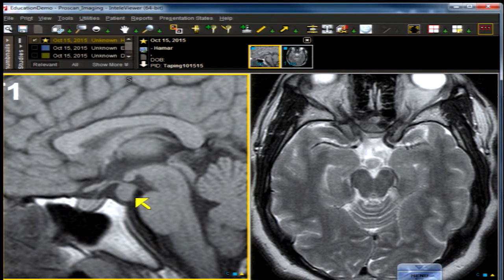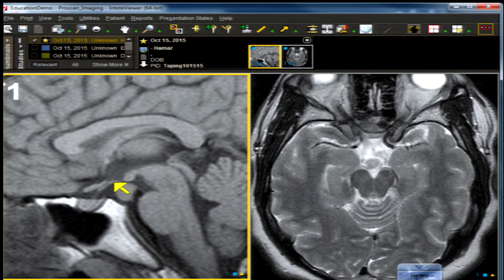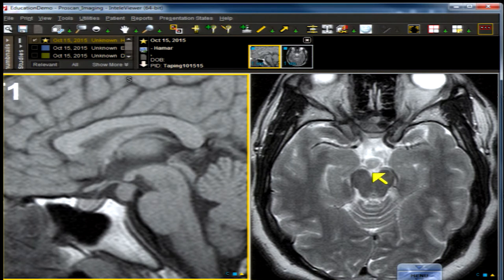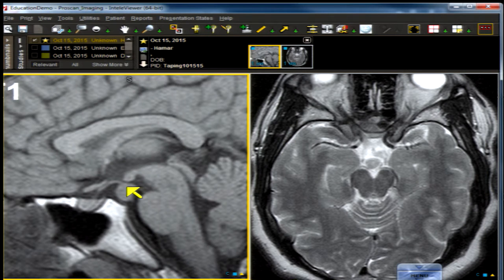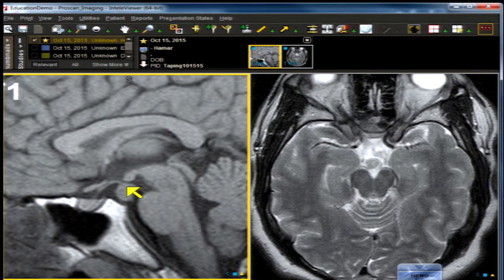Although we did not give contrast, typically there is little to no enhancement — most frequently no enhancement at all. The lesion can be separated from the pituitary stalk and from the optic chiasm and optic tracts that course around it. In the axial projection, the lesion sits right in the midline in front of the interpeduncular cistern. On T2 imaging, the lesion is iso-intense with gray matter, as it is on T1.